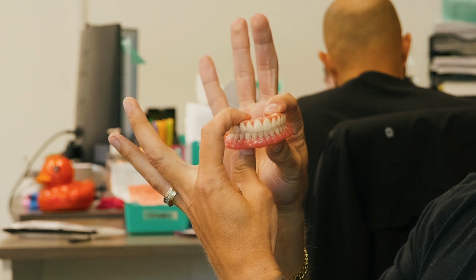So the uppers will get immediate loaded, and then the lower denture, basically all the lower teeth are gonna come out, some bone reduction, and then we'll use probably a smart denture conversion process. And then we'll do a conversion here, but now we've got 2 of the same materials, both 3D printed Onyx Tough 2 resin, that'll be immediate loaded in a couple weeks.